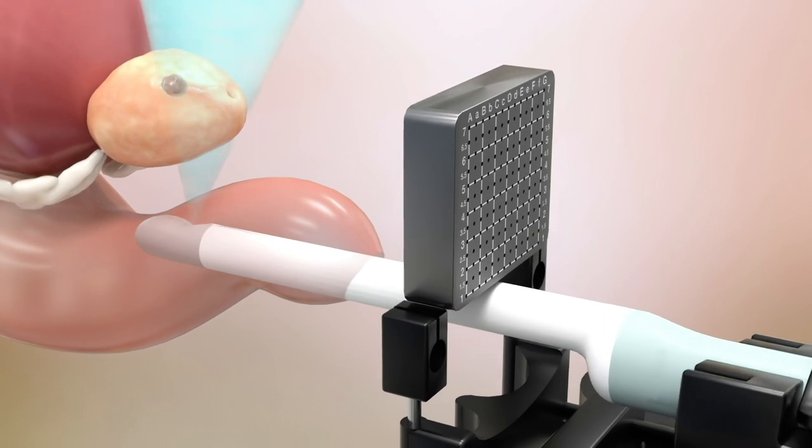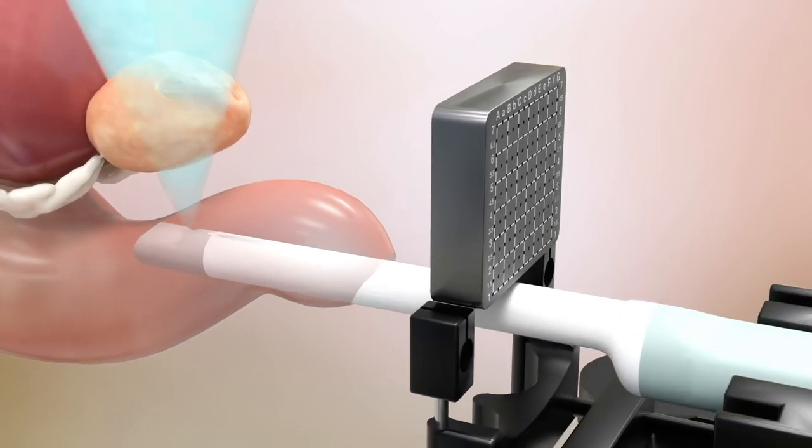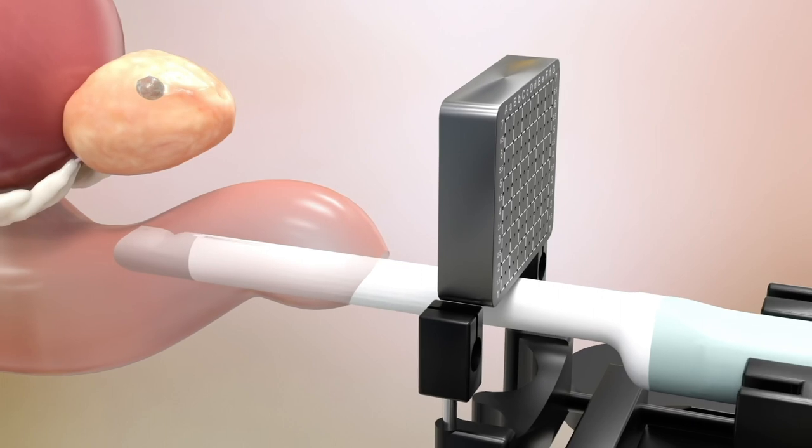After registration, the doctor uses the Fusion software and ultrasound, or micro-ultrasound, loaded with the treatment plan to identify the target lesion.